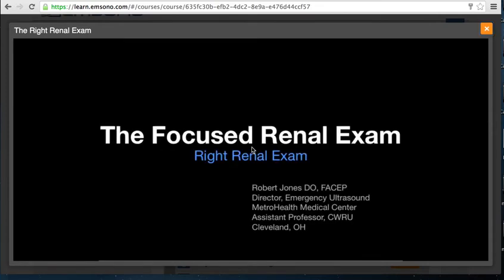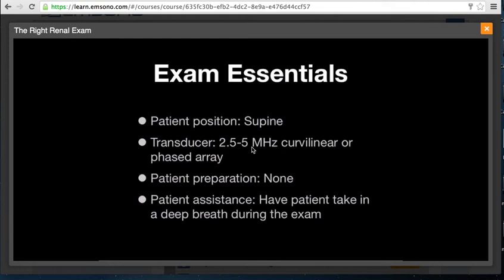I'm Dr. Robert Jones, and in this lecture we will cover the focused renal exam of the right kidney. The renal ultrasound exam on the right as well as on the left is performed with a 2–5 MHz curvilinear or phased array transducer. The phased array transducer would probably provide superior imaging when scanning intercostally. The highest frequency possible should be used: 5 MHz in thin adults, 3.5 MHz in average-sized adults, and 2 MHz in larger adults. No patient preparation is required, though having the patient take a deep breath can move the kidneys more caudal and allow subcostal scanning.